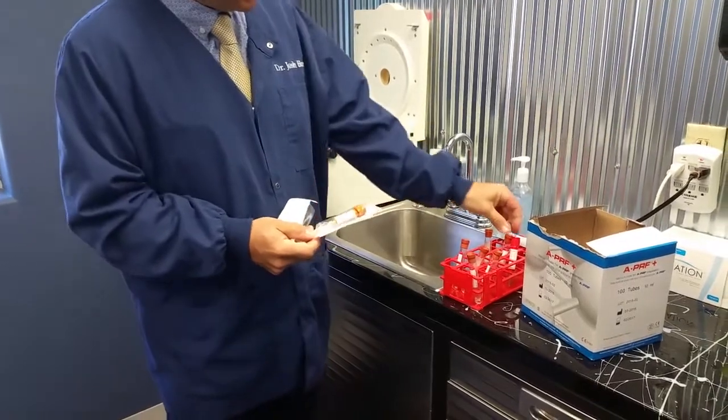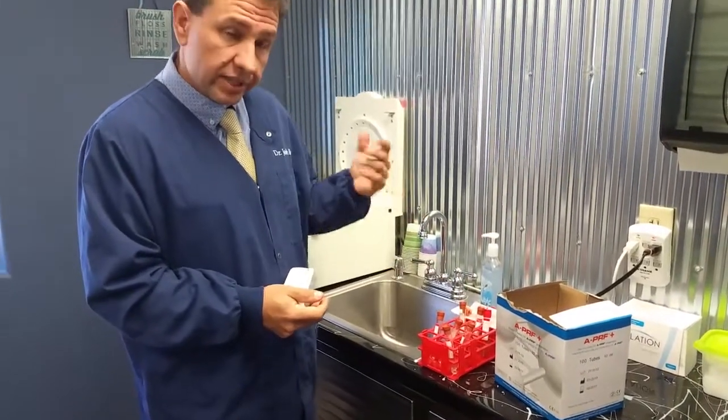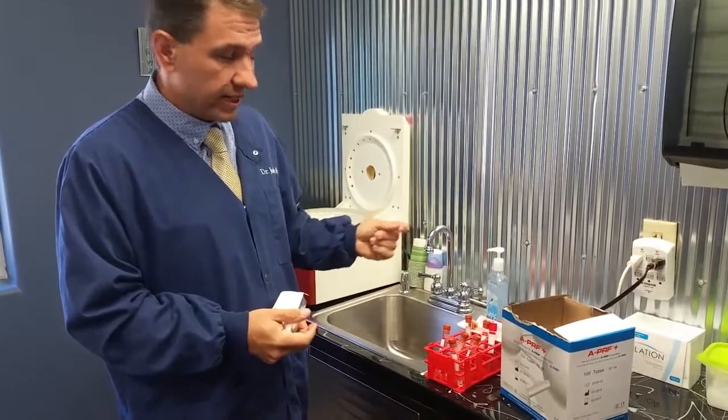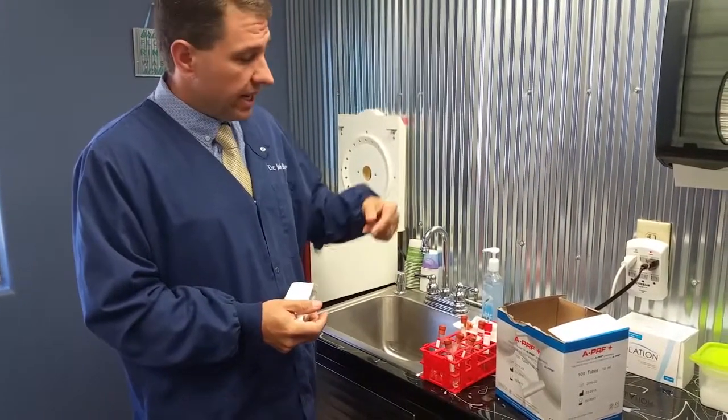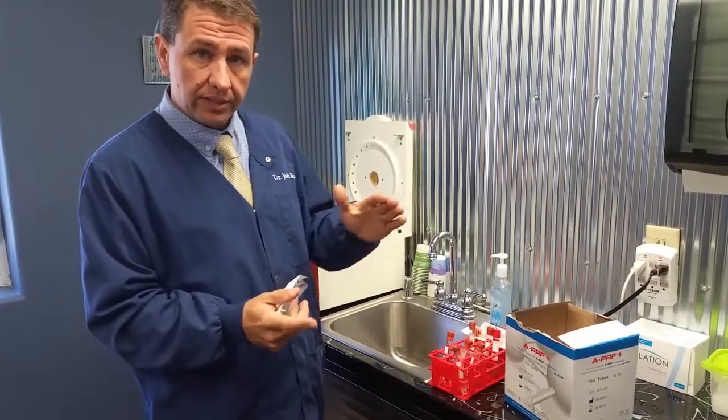The difference is that in the red tube, they're silicone coated, and when the blood that you've collected hits the silicone, it actually starts the clotting cascade. As that cascade happens, you need to spin it down so that you can pull out the different levels.